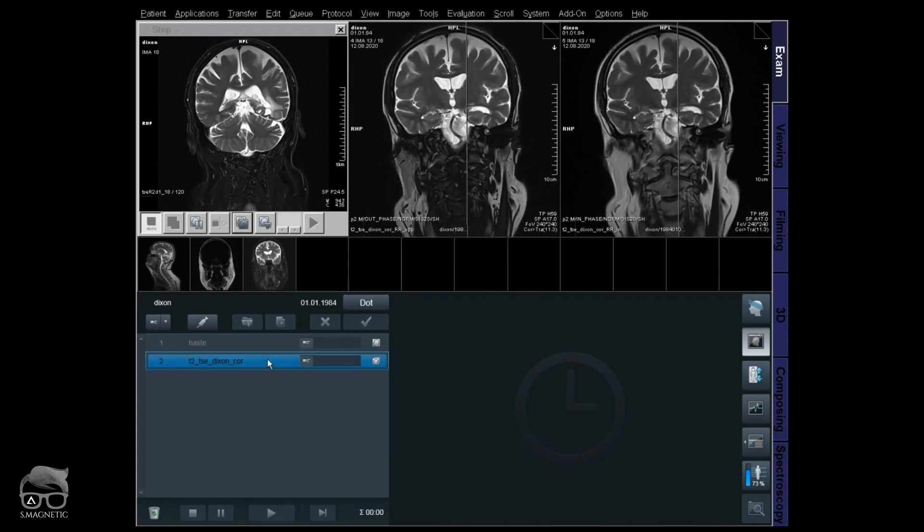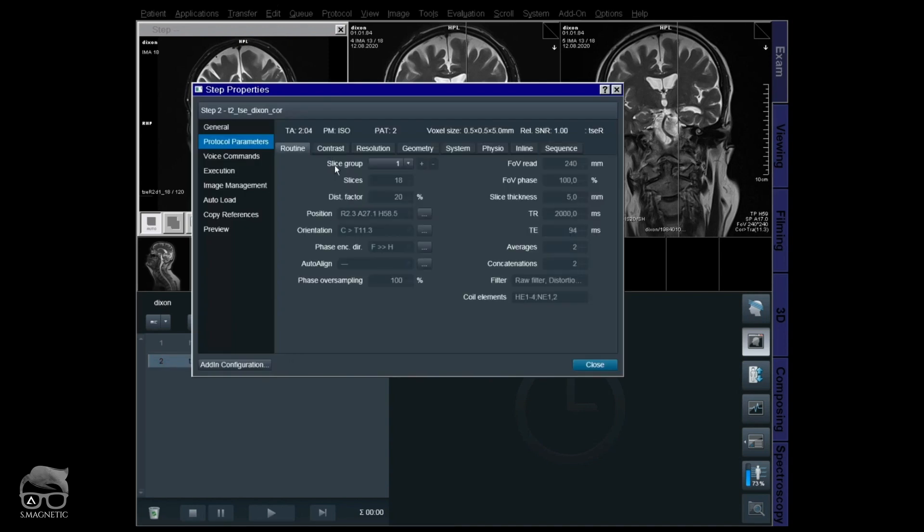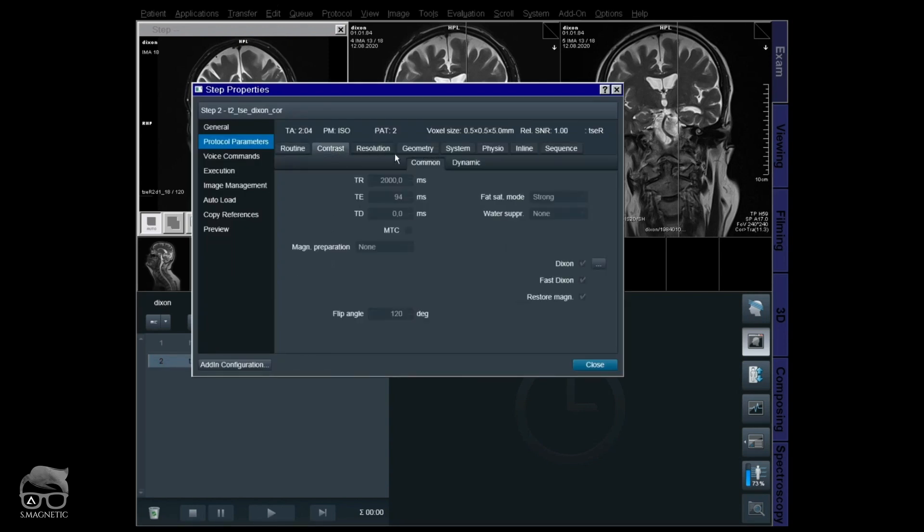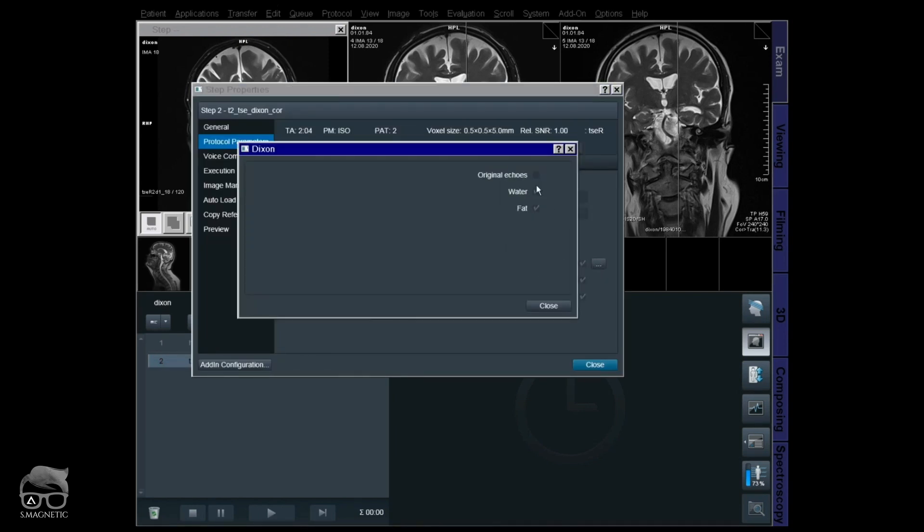Let's double check our scan. Just double click there. Contrast, Dixon. You see I missed original ones, but we managed to bring those back by doing a retrospective reconstruction after the scan is done.